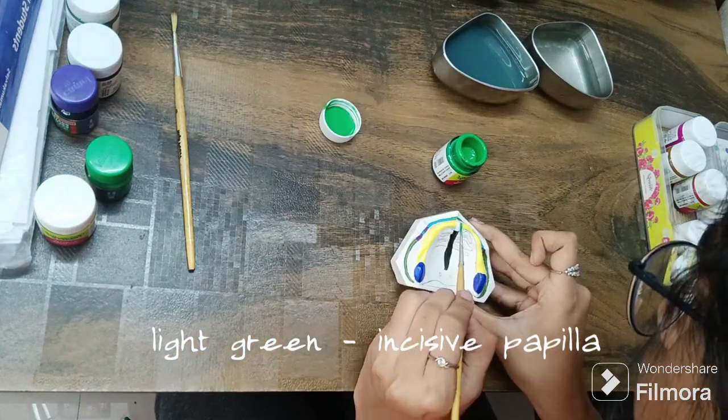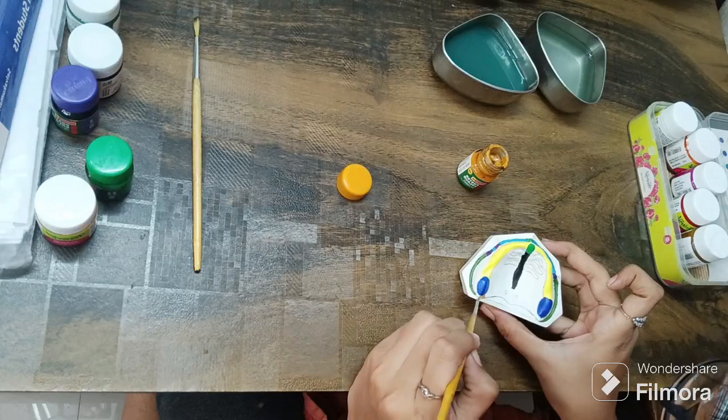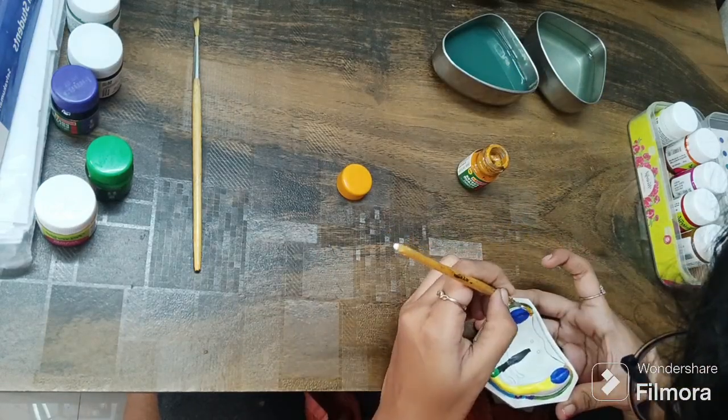I have used acrylic light green color for the incisive papilla. This poster color, which is peach, is used for the hamular notch region on both sides.